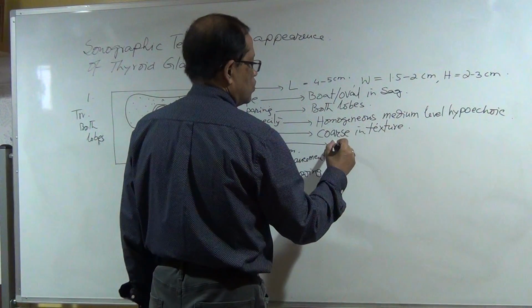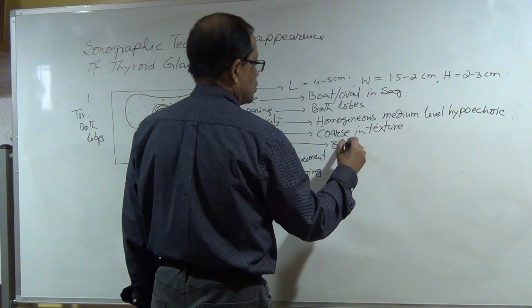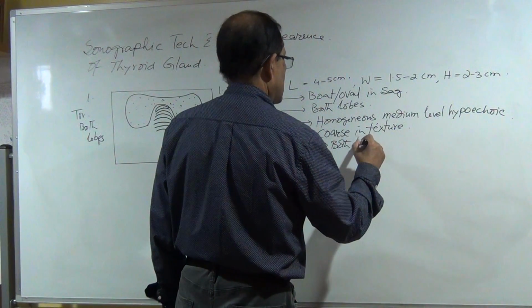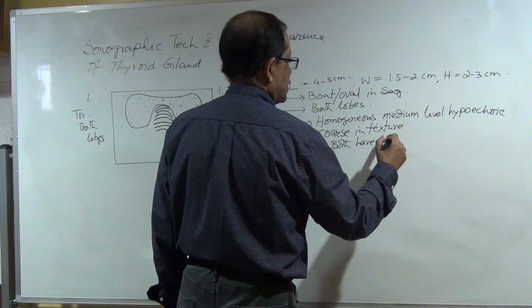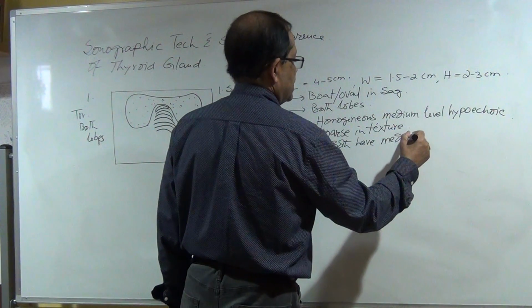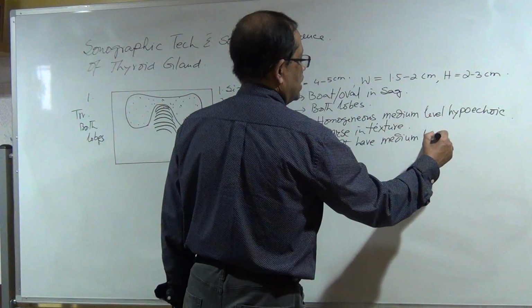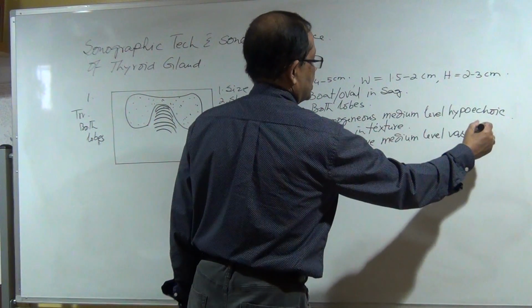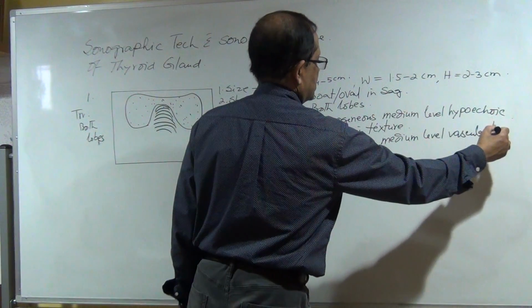Vascularity: so both have medium level vascularity.